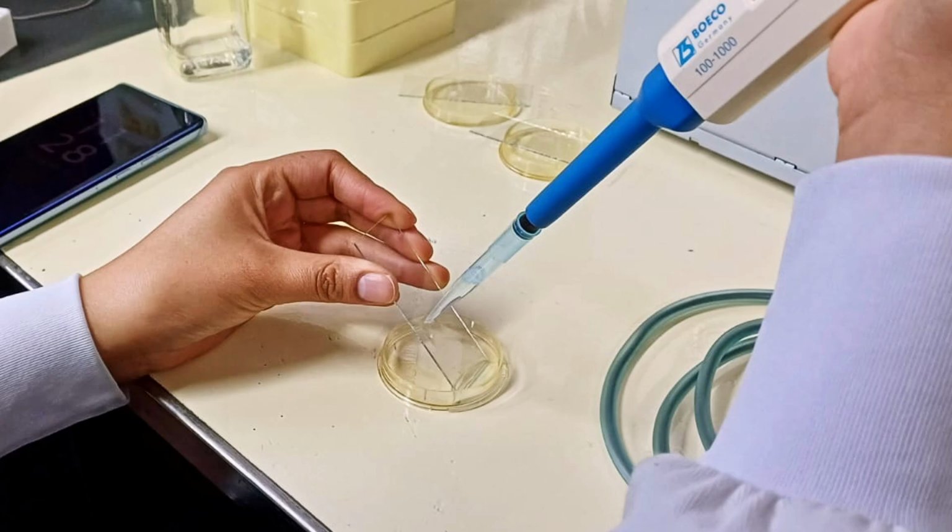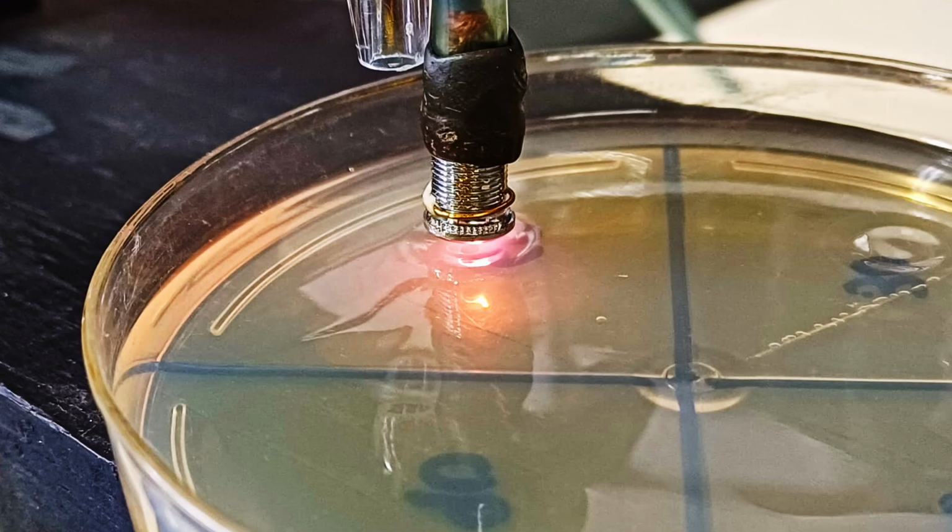The bacterial deactivation trials consisted of two different strains of microorganisms. Both strains were prepared applying the same procedure. Each inoculated agar plate was exposed to the LTP generated in helium supplied at a flow rate of 1 LPM, and an RF electric power set at one of three different magnitudes: 12, 14, and 16 watts.